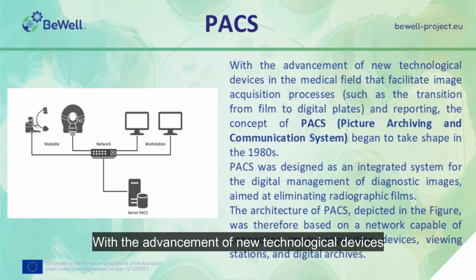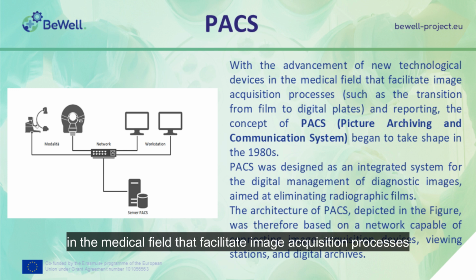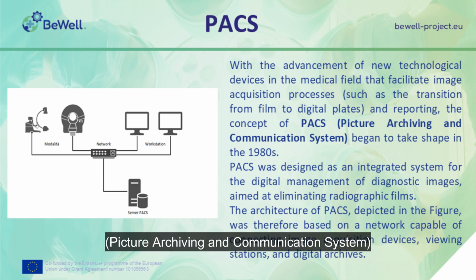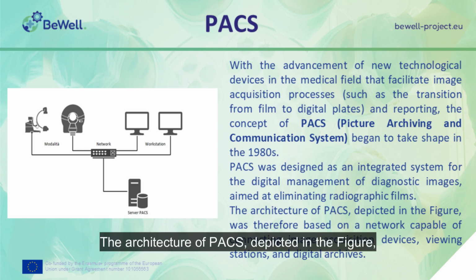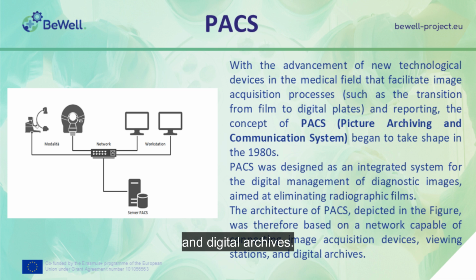Hello. With the advancement of new technological devices in the medical field that facilitate image acquisition processes, such as the transition from film to digital plates, and reporting, the concept of PACS, Picture Archiving and Communication System, began to take shape in the 1980s. PACS was designed as an integrated system for the digital management of diagnostic images, aimed at eliminating radiographic films. The architecture of PACS, depicted in the figure, was therefore based on a network capable of connecting image acquisition devices, viewing stations, and digital archives.